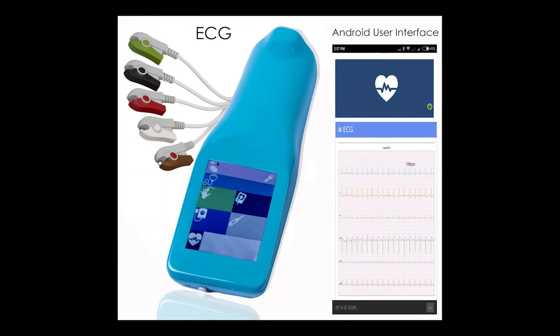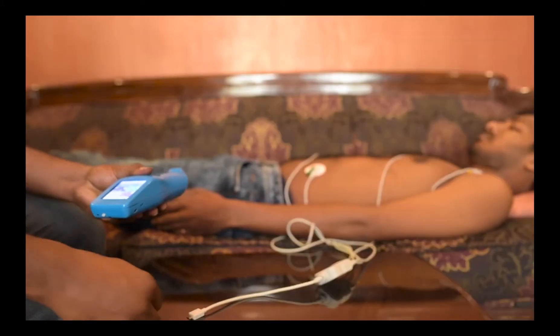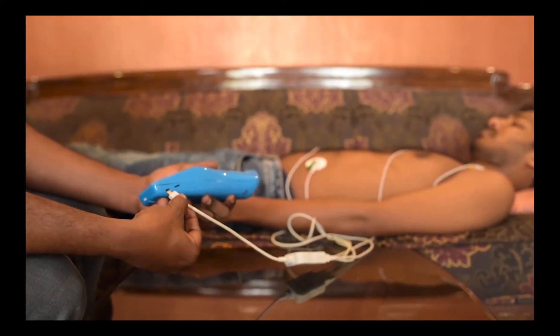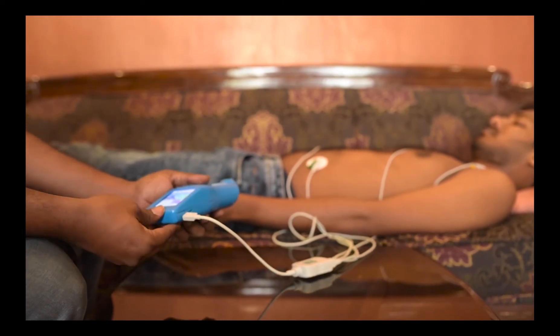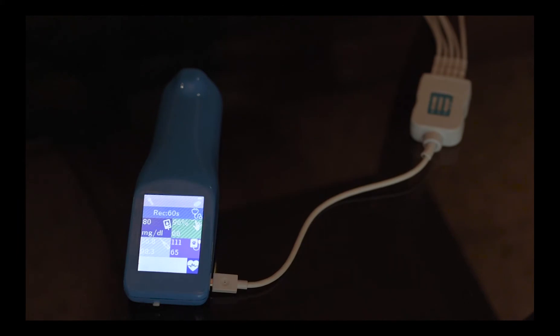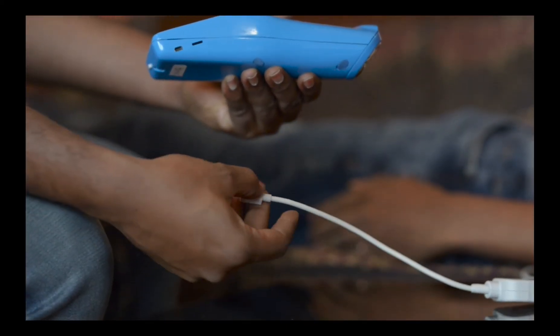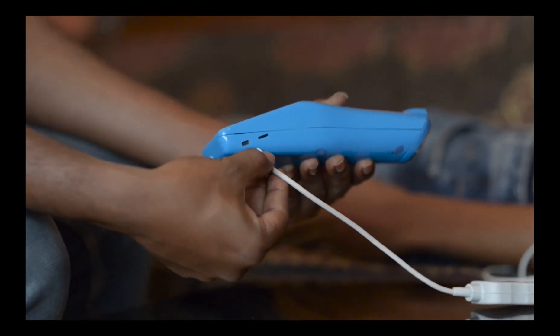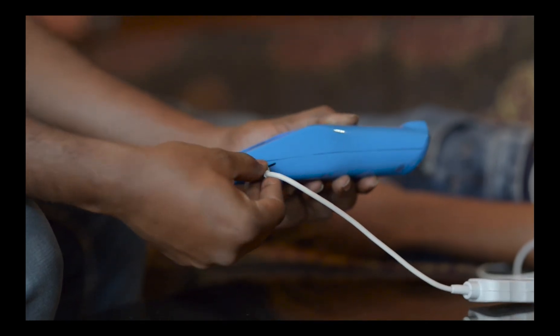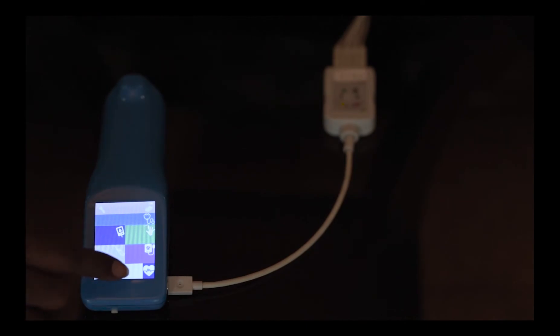We shall now measure the ECG or EKG. We have two variants: the 3-lead and the 12-lead variant. Let's first discuss troubleshooting. Once we place the leads as desired, it is important to make sure that the connection of the pigtail to the main device is adequate. If not, it shows up as a check cable error on the screen. It is therefore important to connect the pigtail flush with the unit as shown in the video. The device needs to be placed securely and flat on a surface before we activate the measurement. Once properly connected, you can see that the 3-lead ECG has begun capture.